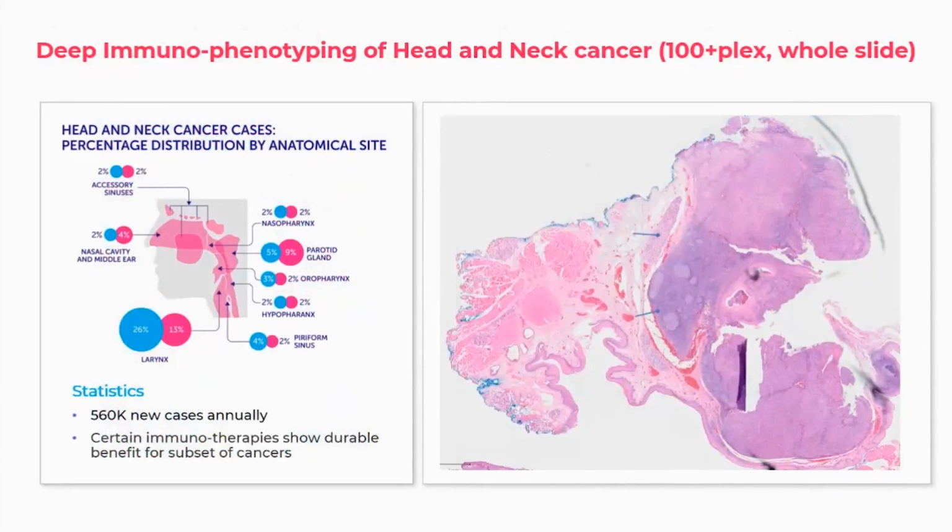It's an index sort of study that we've run, really showcasing the power of spatial. This is over 103 antibodies stained on a single tissue section in head and neck cancer, HPV positive disease. This patient died after 14 months. We had the pre-IO specimen, and so we knew that this patient would inherently have resistance within their tissue. And so we went in trying to find out whether we could identify it.